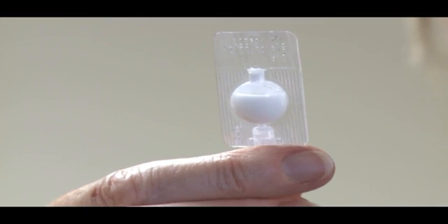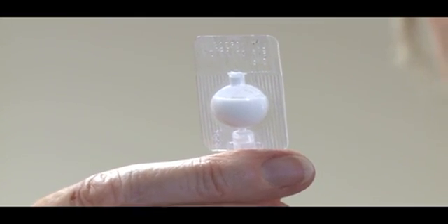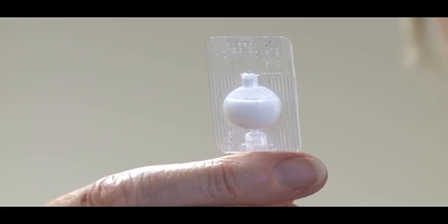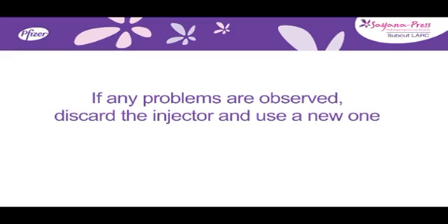Look at the injector and confirm that the liquid contents of the reservoir appear white to off-white and are uniform. There should be no leakage from any part of the injector. If any problems are observed, discard the injector and use a new one.